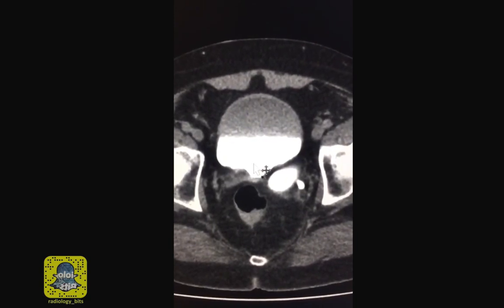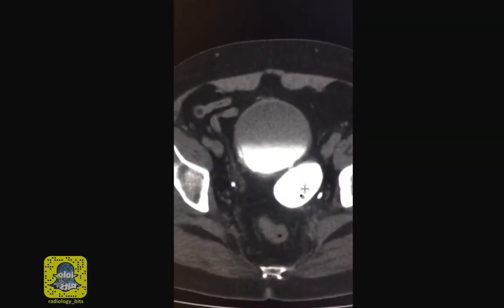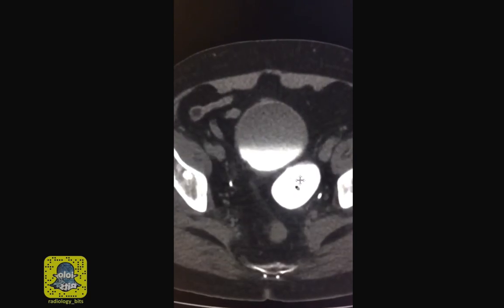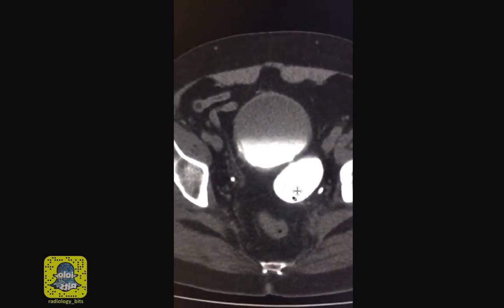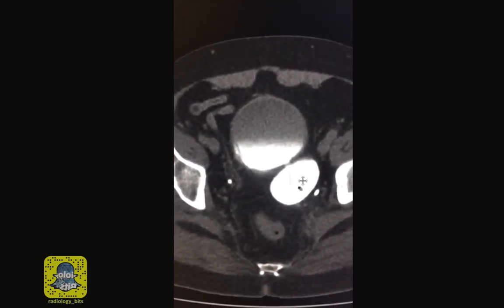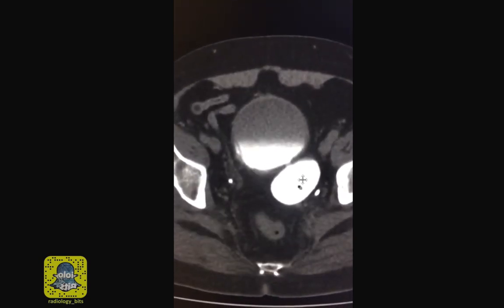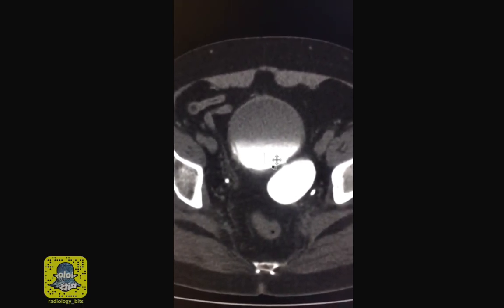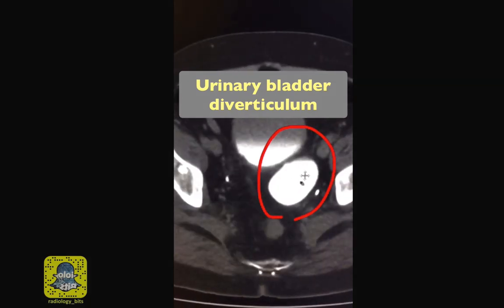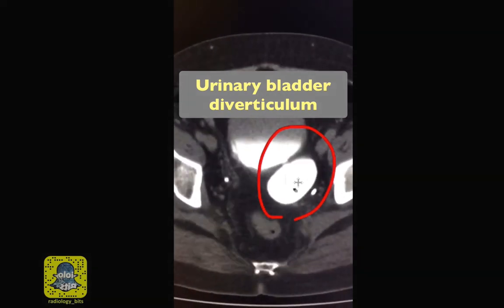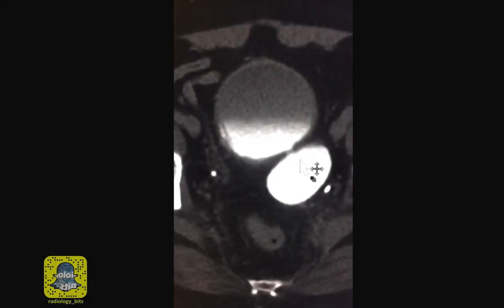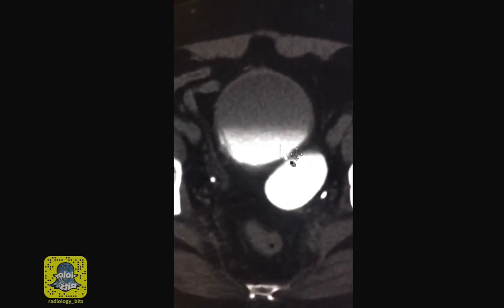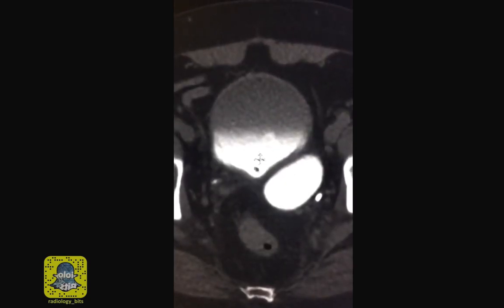Here you can see there is some connection between the urinary bladder and that adjacent structure, and partially by the effect of gravity the structure is filling with the dependent contrast — similar to what we saw in the urinary bladder. So that's confirmation that this is connected to the urinary bladder, and this represents a urinary bladder diverticulum.